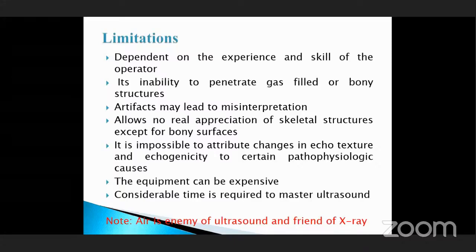The equipment can be expensive, or you can say the initial cost of investment is high, and considerable time is required to master the ultrasound. And one thing you must know, that air is the enemy of ultrasound and friend of X-ray.